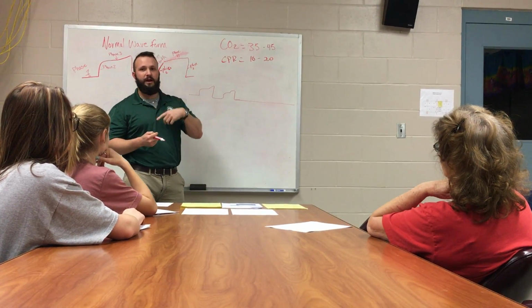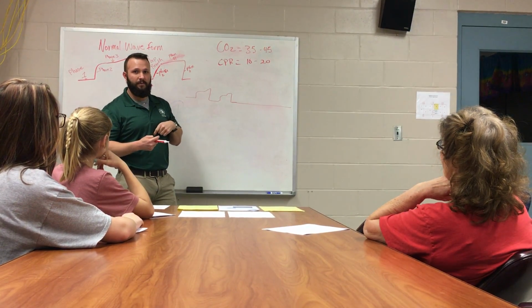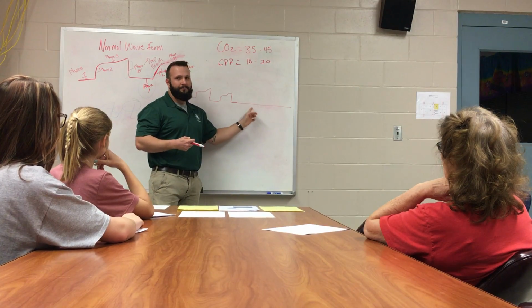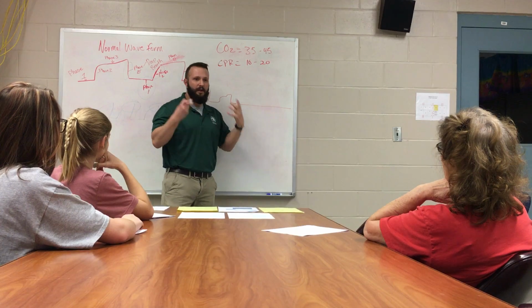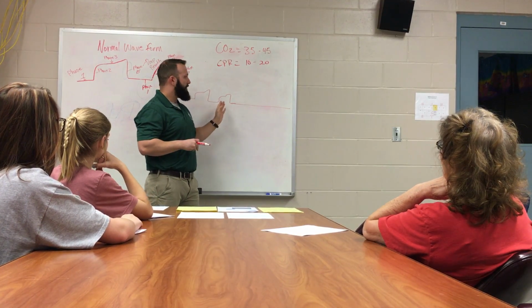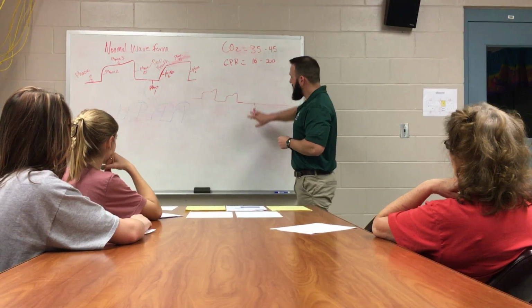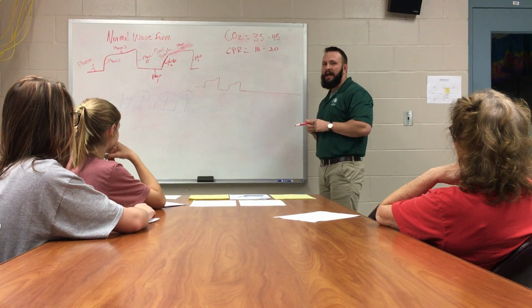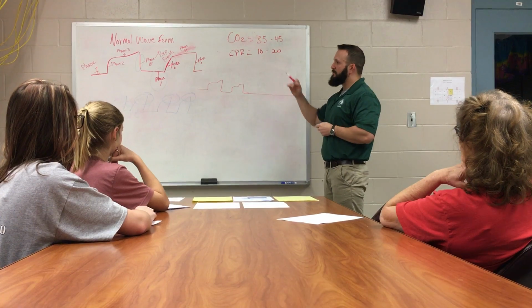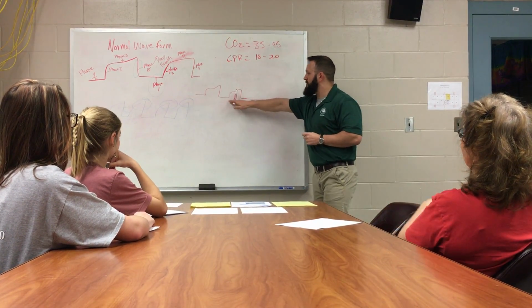So you have two holes. You have an esophagus and you have a trachea. If your trachea is into your lungs, your esophagus is into your stomach, and I just pulled it out, I can know right now that I'm no longer in my lungs. I know that oxygen is not going to be perfused because I do not have the delivery system there anymore. The tube is out of the trachea where it needs to be. So this is an immediate reading. So as a nurse, this is the best thing I can have for my intubated patient, to know that they're getting the best standard of care, because I know they're getting perfusion.